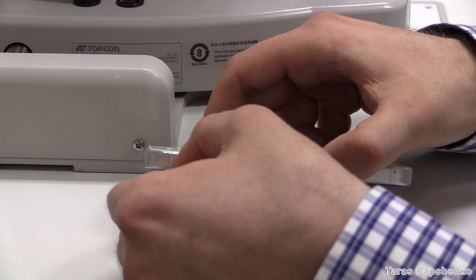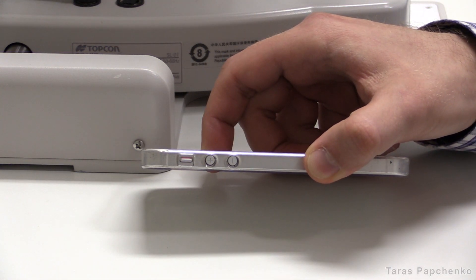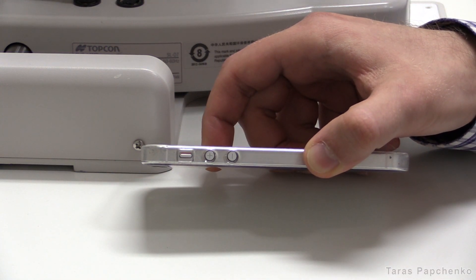Switch your phone into silent mode, as you will need to take several shots and the frequent sound of the camera shutter gets annoying.